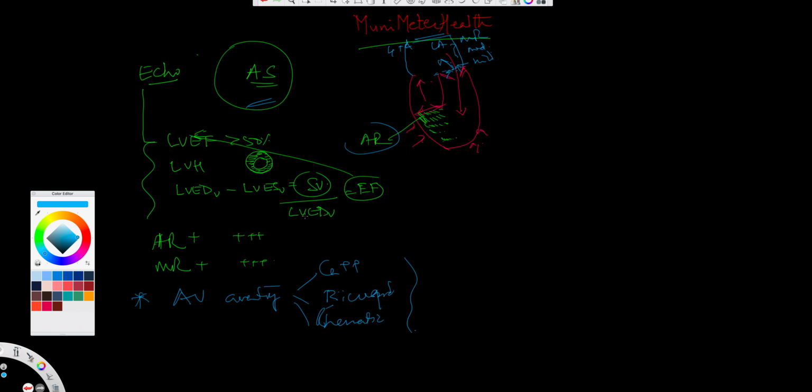So now, what do you understand from that? Basically, what you're doing is drawing, in a schematic form, the aortic annulus, where if you're looking at it from the short axis, this is how the three leaflets will look. But when you look at a bicuspid valve, it will look more or less like this, so you'll have two leaflets. Normally, we have an aortic valve with three leaflets. As you know, it's a trileaflet valve.